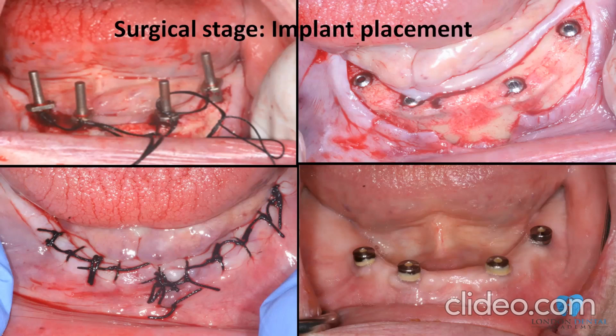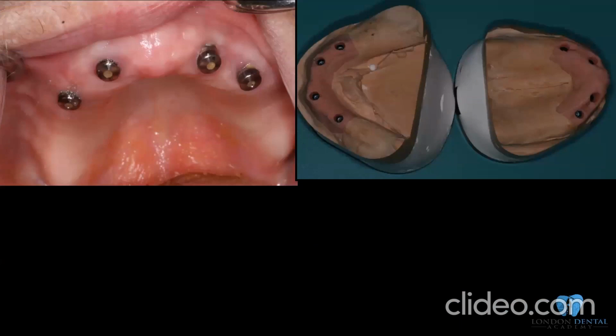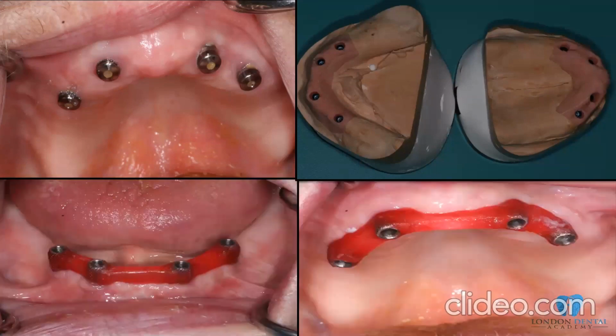4 implants, as you can see, relieving incision in the midline, 4 implants, extra implants, and then submerged. At the later stage, can you see the patient can't even brush? A lot of calculus around the healing abutments. And then standard impressions. I always use open tray, never closed tray unless there are some conditions, especially limited mouth opening. Nicely positioned implants on the upper and lower arches.